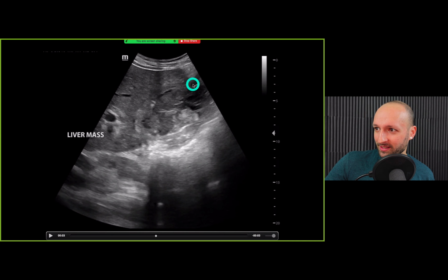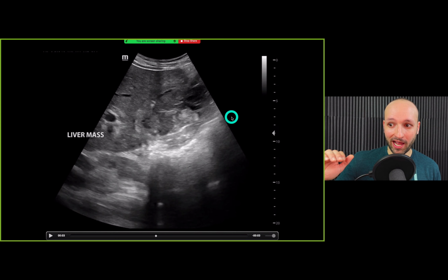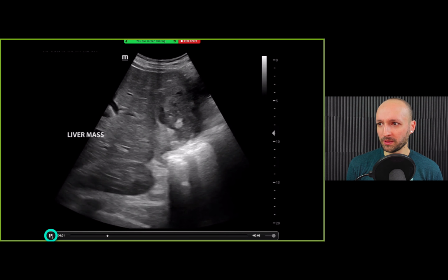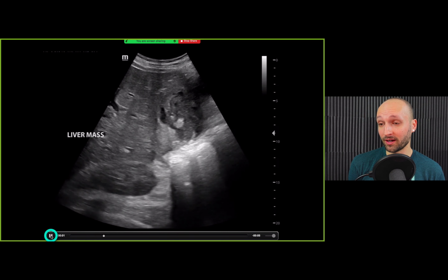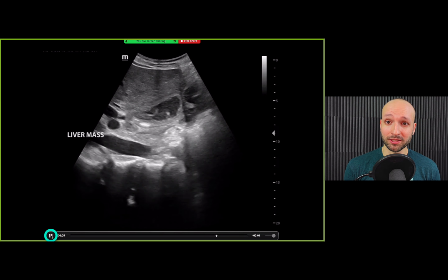And this is a huge, turns out, gallbladder abscess. It's a big old gallbladder abscess that was first looked at by one of our PGY1s, Jessica Atkins. She did a great job on it. Are you guys able to see that there? I have to be honest, I haven't seen very many of these gallbladder abscesses before, but that's what a gallbladder abscess looks like.